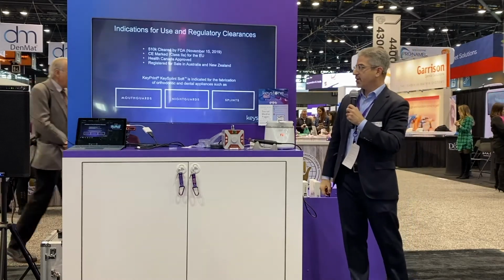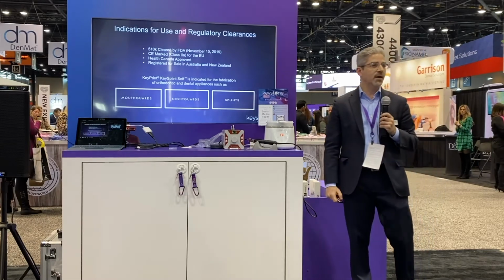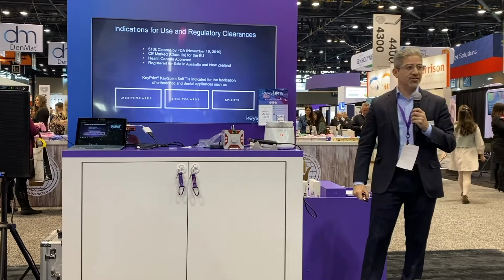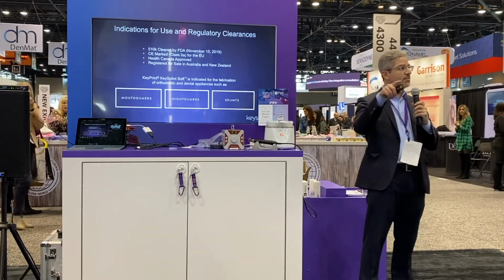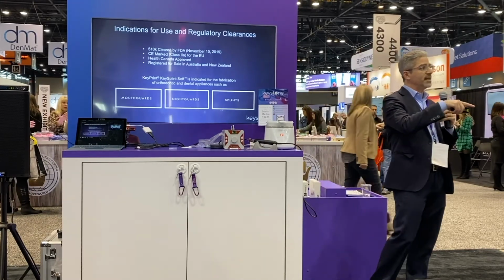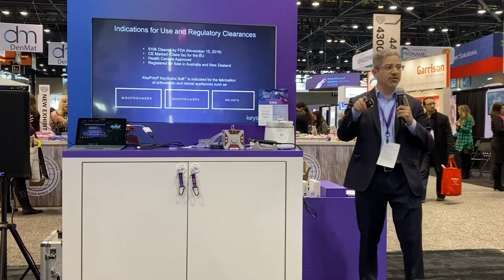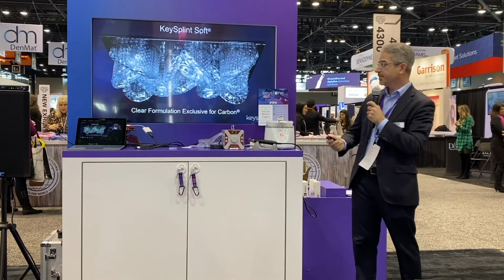So what you've got is clearance in Canada, Europe, Australia, and the US. Your approved applications in the US are mouthguard, night guards, and splints. EU and Canada have a couple additional applications that the FDA was uncomfortable with for this, and that includes some snoring devices for those markets. So just keep that in mind. You'll notice the IFUs are a little bit different because of the different clearances in different markets.